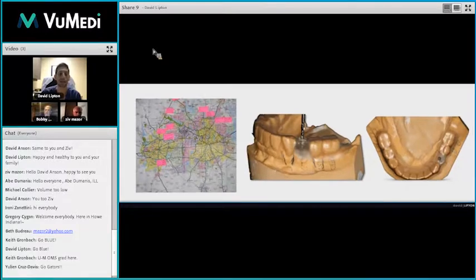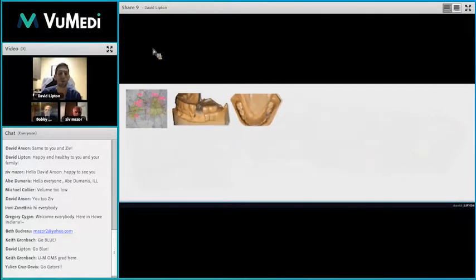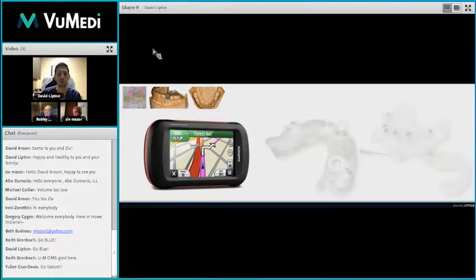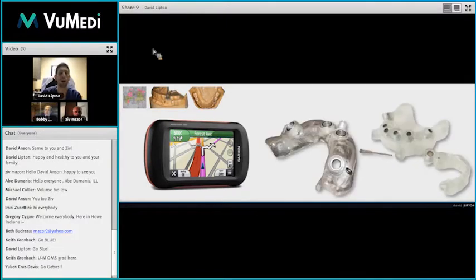Well, we know technology advances, so what came along with navigation were these third-party devices that would give you digital navigation that you could take from car to car, but you had to go to the store and purchase it. That was similar to our surgical guides that we would purchase from a company that would mill them and then ship them to us, which would take anywhere from a week to 2 weeks, depending on where you would get them from. But of course, technology has continued to advance.